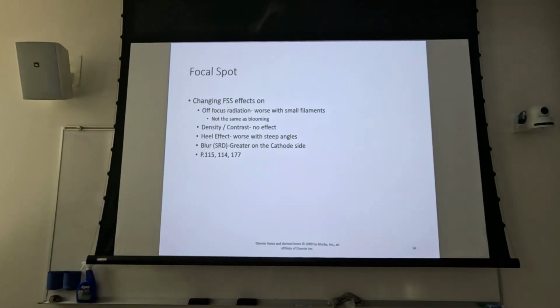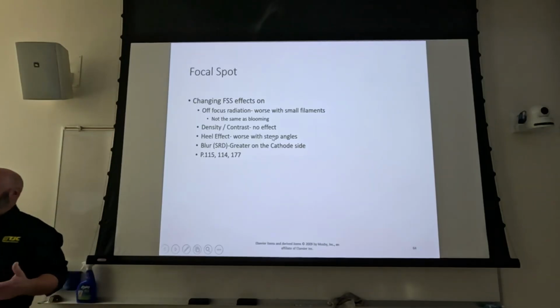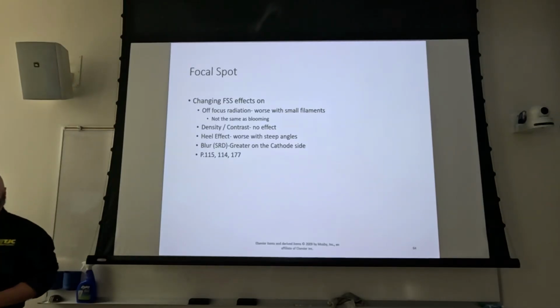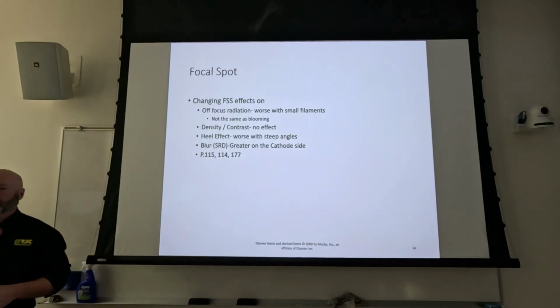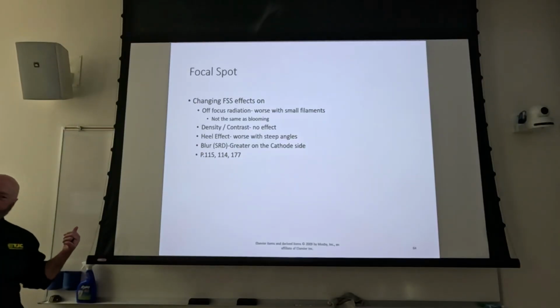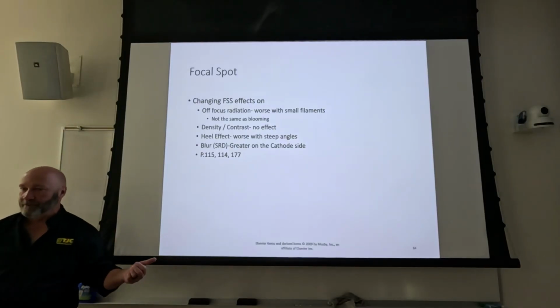It has no effect on contrast or density. Let's say you're looking at a number of colors and you let your eyes go out of focus. You start to cross your eyes. What happens to the appearance of those colors? They kind of get fuzzy and harder to distinguish, right? So the same thing can happen with contrast, but that's really due to a loss of sharpness or recorded detail.